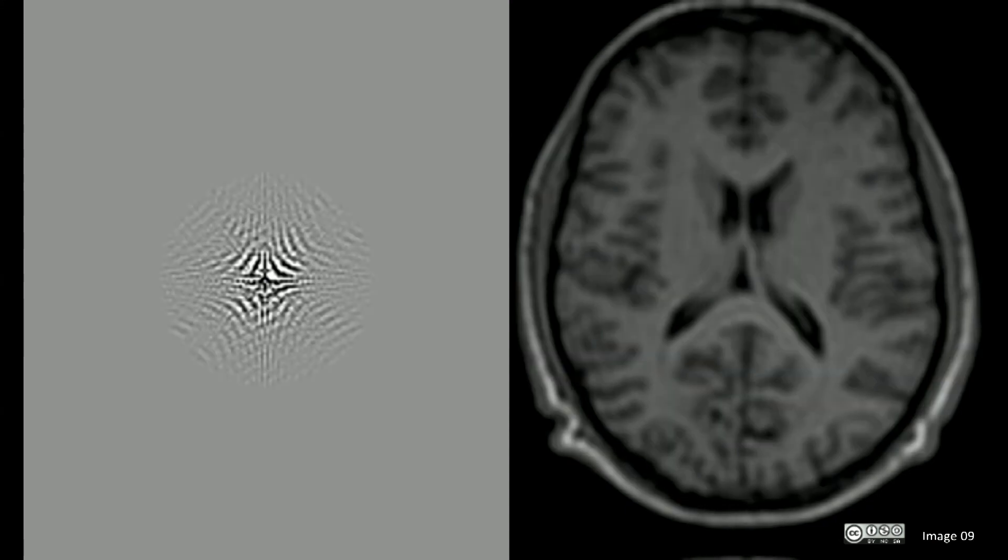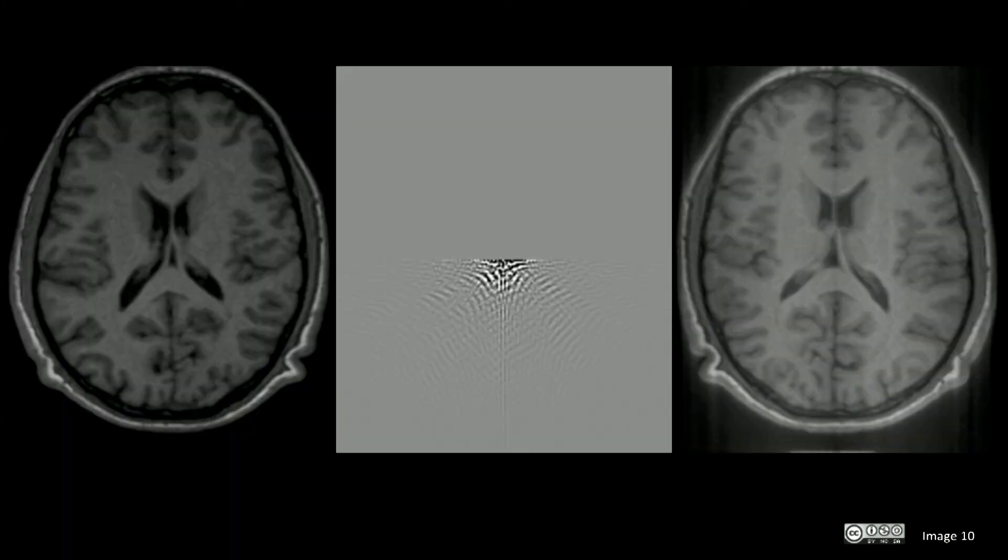Another technique that is often used to increase speed of an acquisition is to acquire only half of the k-space data and then mirror this to the other side. This image shows how this will affect the acquired image on the right hand side.